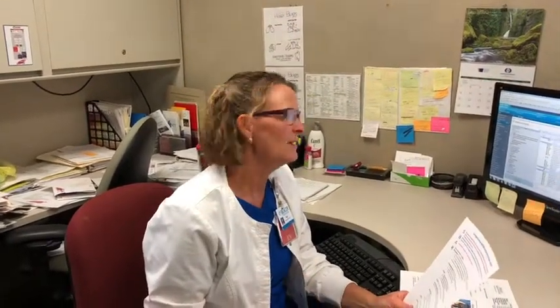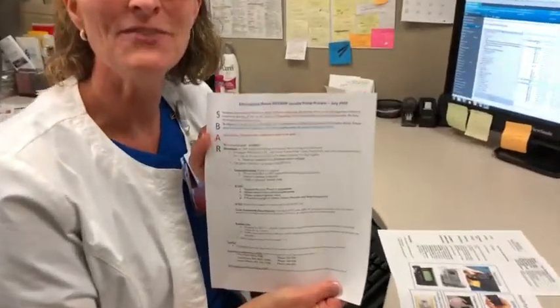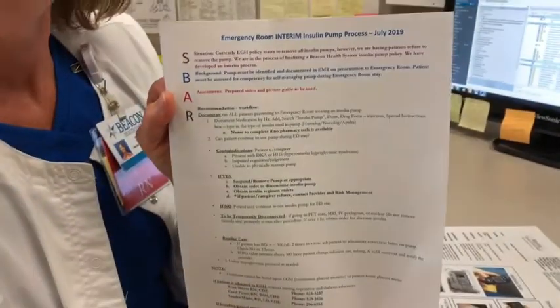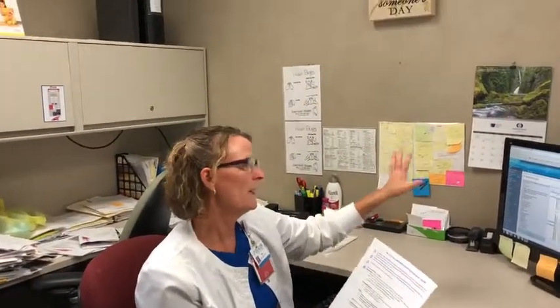I'm going to explain how to do the new emergency room interim insulin pump process that is going to go live on Monday, July 15th, I think. Okay, and I'm going to send out the SBAR today, which is Friday. And so basically, I'm going to walk through the SBAR with you and go back and forth between the SBAR and what you're doing in documentation and the pieces of the packet, okay?